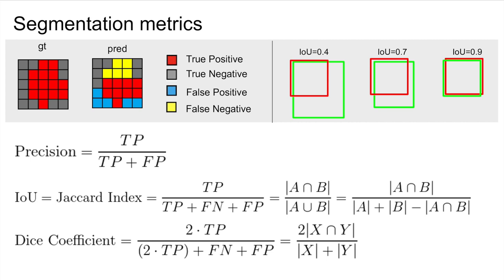When performing image-to-image segmentation, the losses are very important. Here we just look at the binary case. You may have heard of these many different metrics before, but here they are all written with a similar construction for clarity. The main difference is how to value a mistake, and which class is more important. In this form, however, it is hard to use them as a training loss, because everything is discrete.